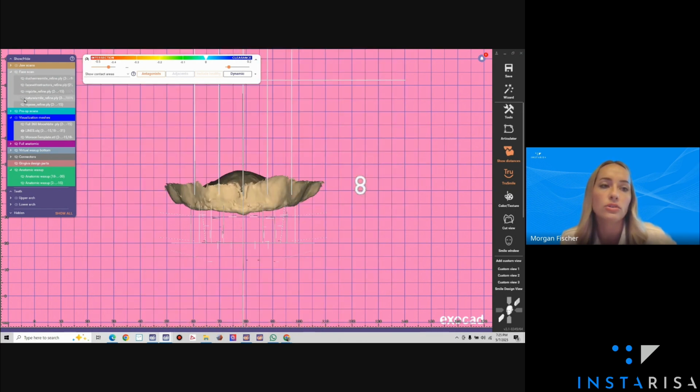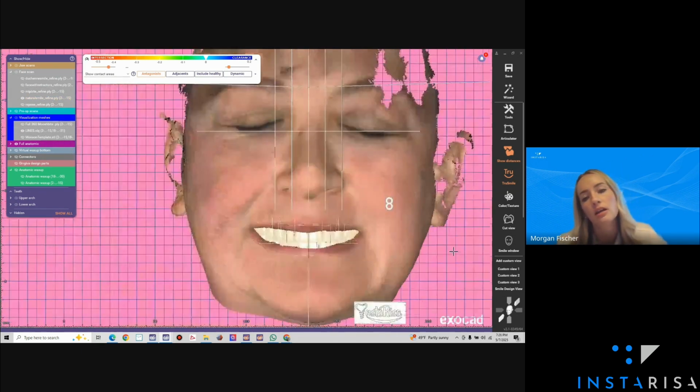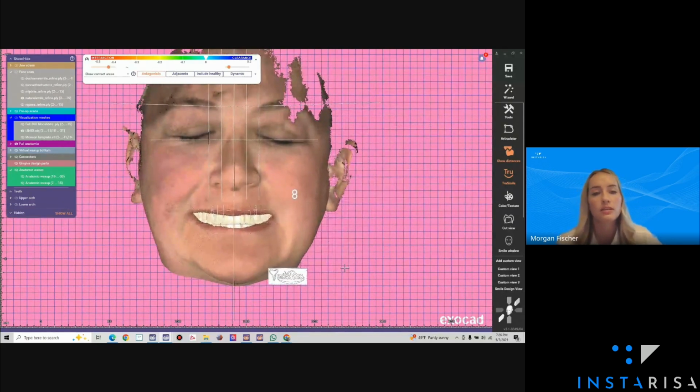And then lastly, I'm going to use my natural smile here to kind of guide my curve of Spee. So I just want to naturally follow that lower lip line to get my curve of Spee here. Let me turn on all of the teeth that I have set. Just one second here. So this is kind of where I set up the teeth. These grid lines that say InstaRisa on them, all of these are set in golden proportion. They're scalable to the patient's face.